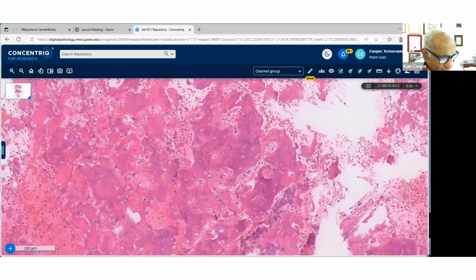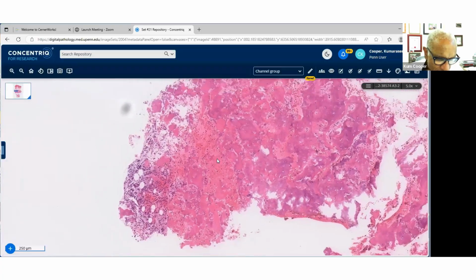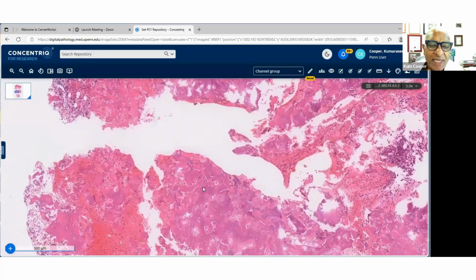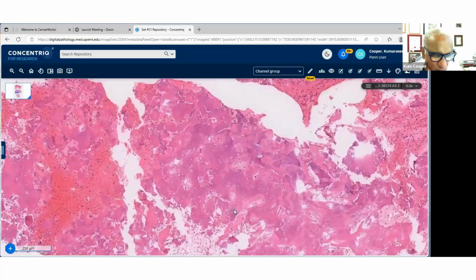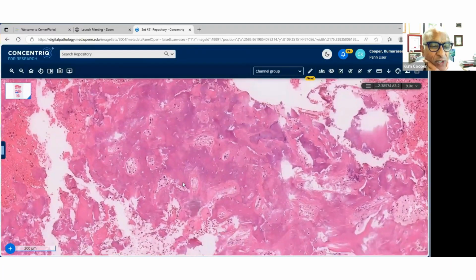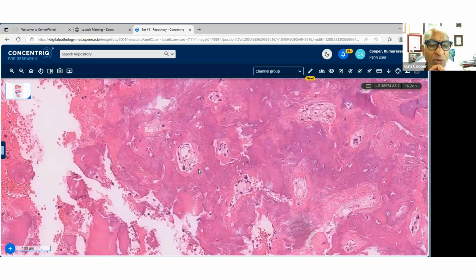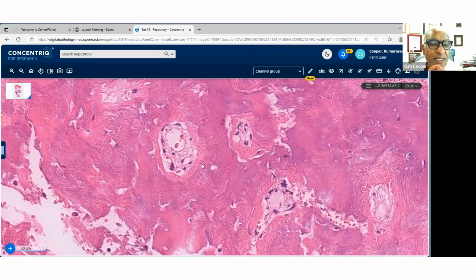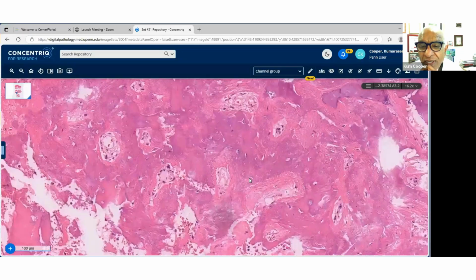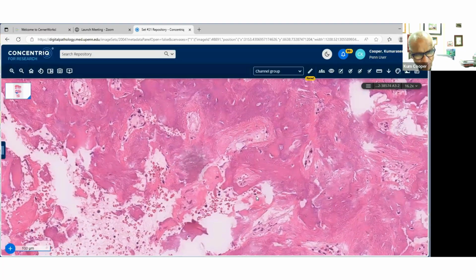Okay, a biopsy typically done in the iliac crest for lesions of the iliac crest is done really to rule out either primary bone tumors or metastasis, and neither of those were present in here. This, in fact, had gone to hematopathology looking for lymphoma, and they sent it over to us. I'm just going to show you here some irregular bone formation where you can see some osteoid seams. This irregular formation, along with the new bone formation and the radiology, is that of Paget's disease.